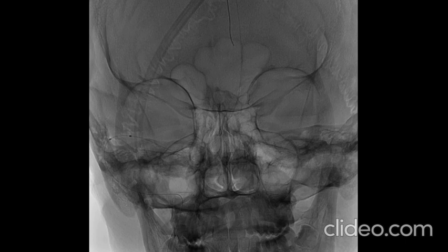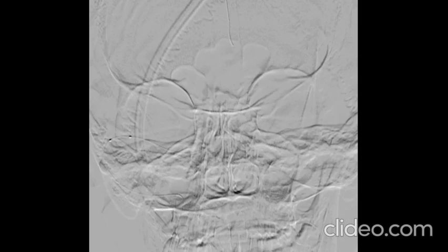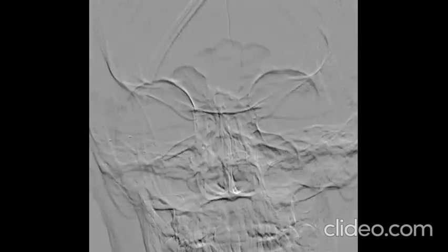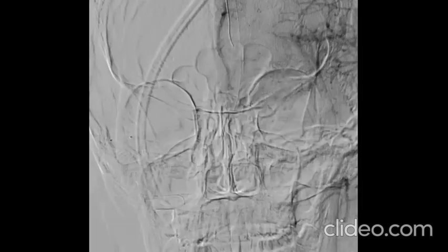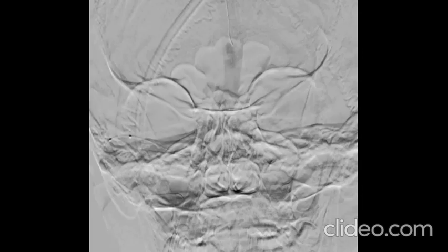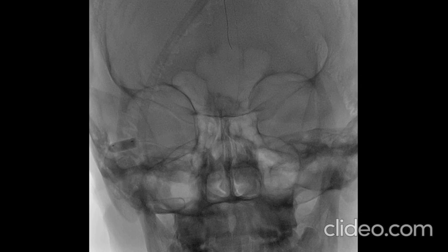Over the microwire, a 5 mm angioplasty balloon was tracked up to the stenotic site. A left CCA injection was obtained and angioplasty of the stenotic site was performed at 10 atmospheres to open up the stenosis. The balloon was then deflated and removed.